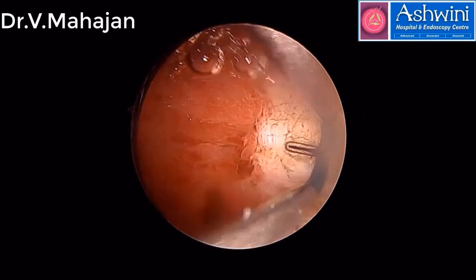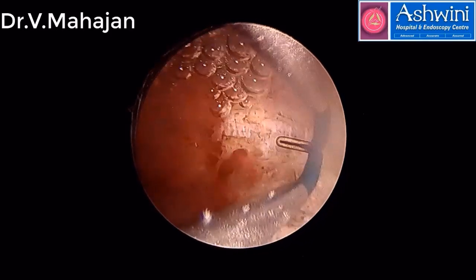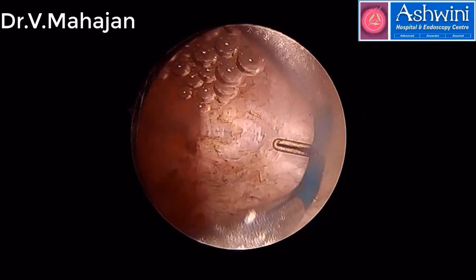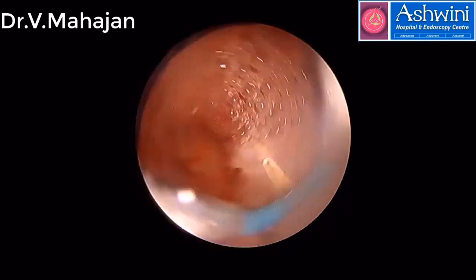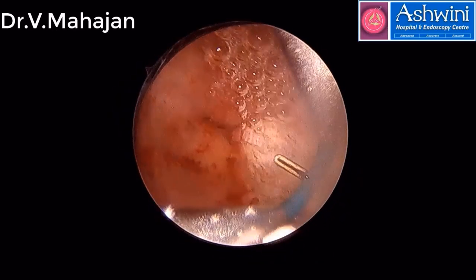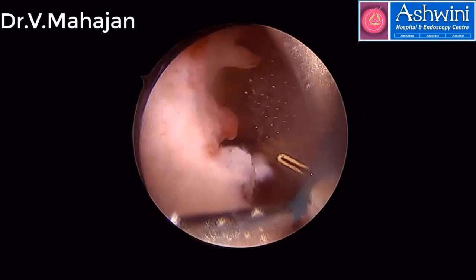At the end of the procedure, without the current, we just push the septal tissue. Sometimes it gets retracted because of the pressure of the fluid, so there is no need to cut. So we are at the end point. I am pushing with the Collins knife. Try to use minimal current as you go towards the fundus. Try to do cold dissection, that is, without the current. So both the ostia are the same, and I think I have completed the septal surgery.